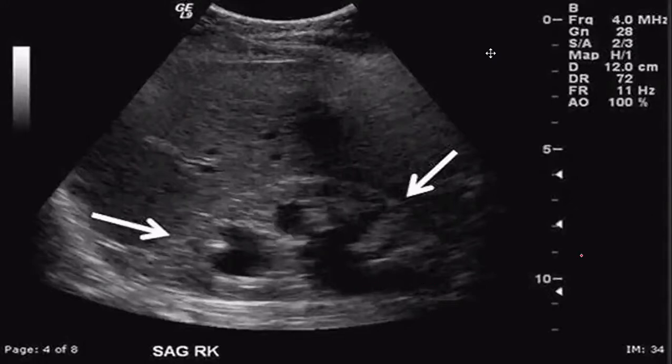Dr. Alcover, do you see already sort of a pelvocalectasia here? Yes, Doc. The blackening. Yes, very good. I told you, join the 4th year na, doctor. So you skip 2nd year, 3rd year na, just joke. Okay, very good.